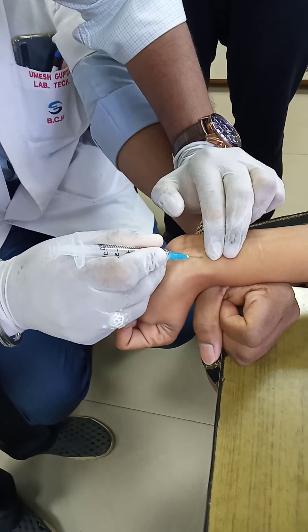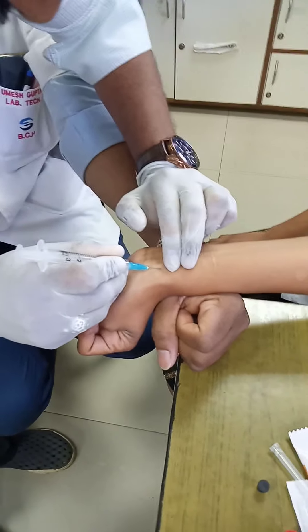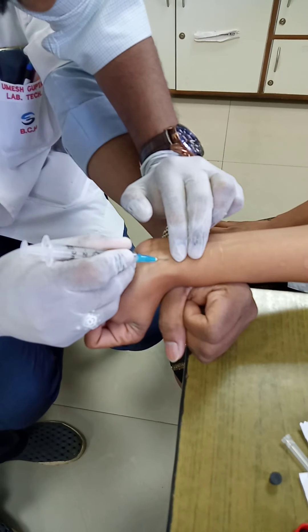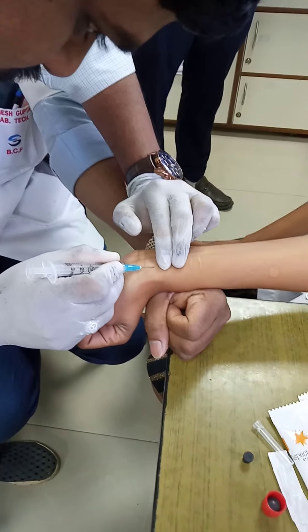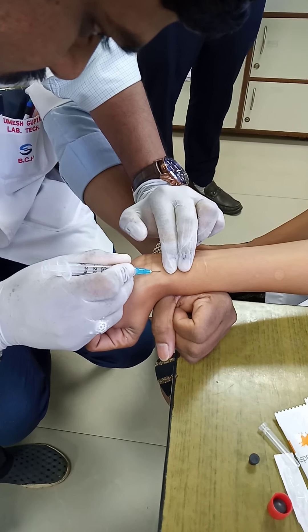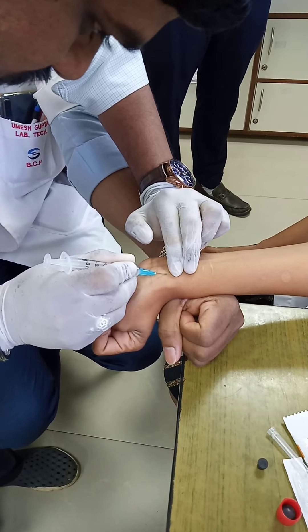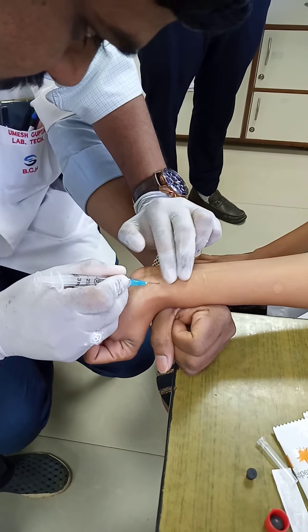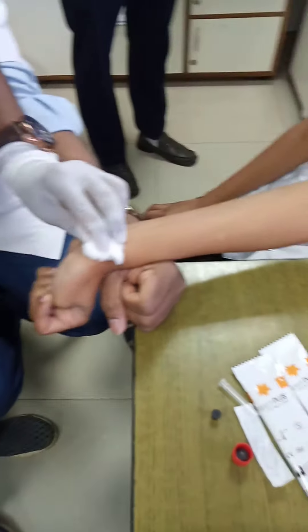Blood has not been seen in the hub. Arterial blood, if collected successfully, would be bright red in color and come out with a gush, as shown in a previous video. The operator tries to manipulate the needle but this is an unsuccessful attempt at arterial blood gas collection. The attempt is abandoned as it is very painful to the patient.